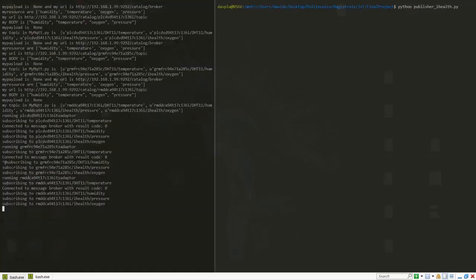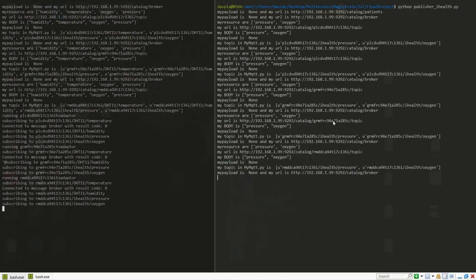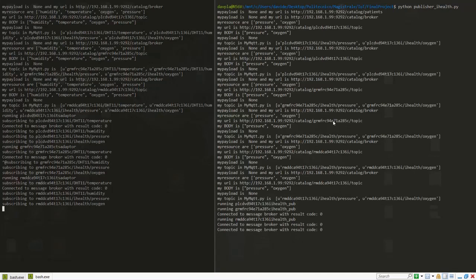Now we will see how the iHealth publisher works. At the beginning it will ask the catalog for all the patients in the list, and for each patient it will run an MQTT client publisher. For each client, this script will ask the cloud for information about the 2 resources, pressure and oxygen.